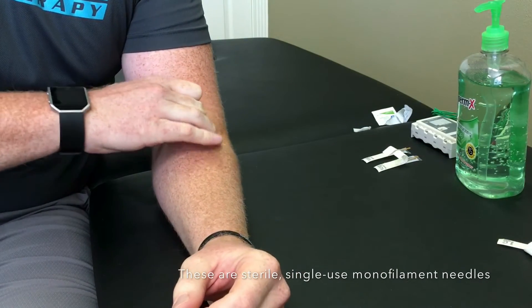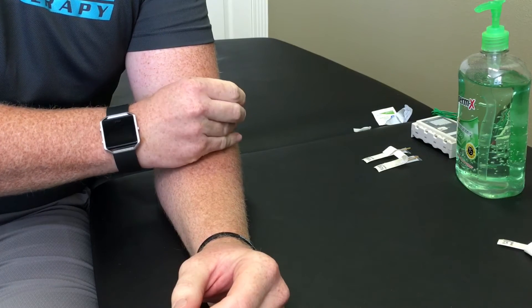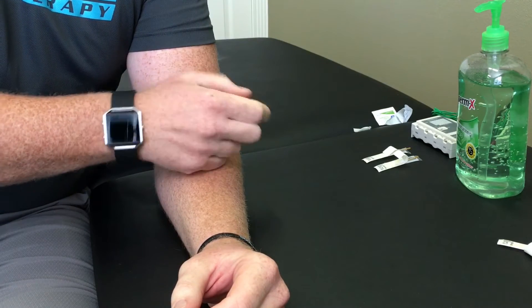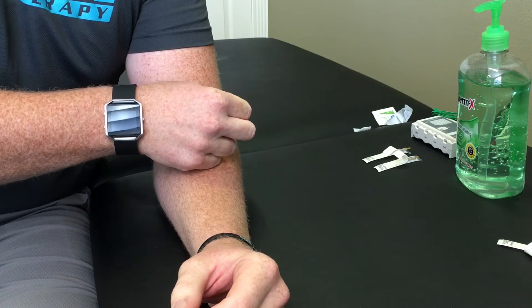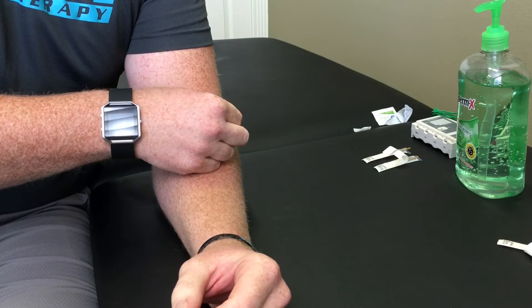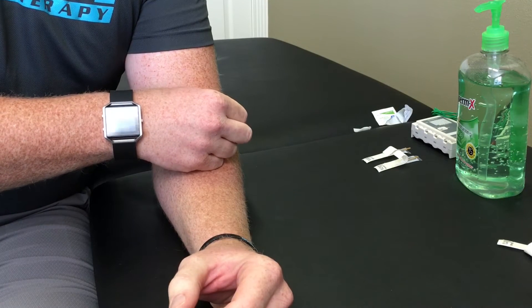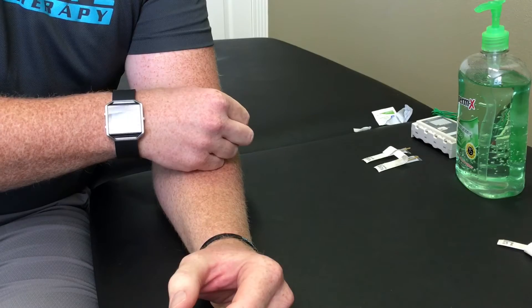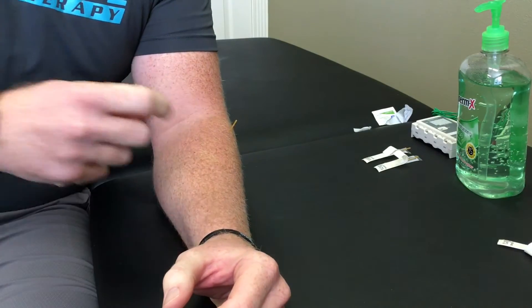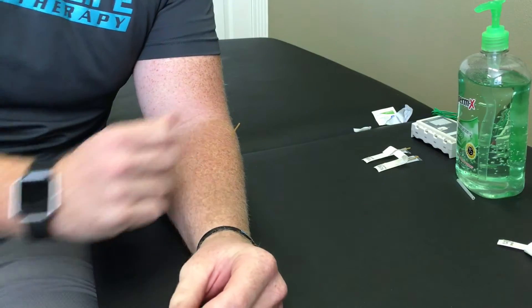So we'll locate the trigger point — which is there — and we'll just tap the needle in place. Put a little twist on it and feel that radiate a little bit into the forearm, so I know I'm hitting a good spot.